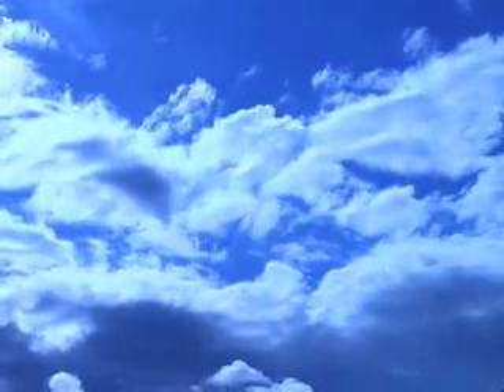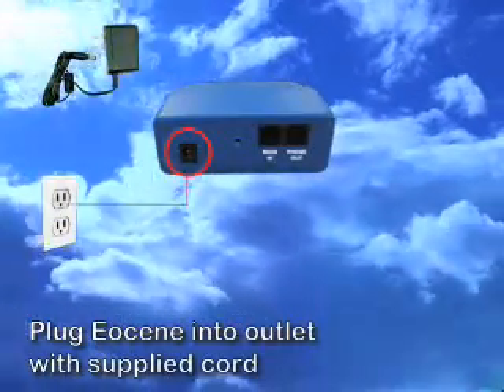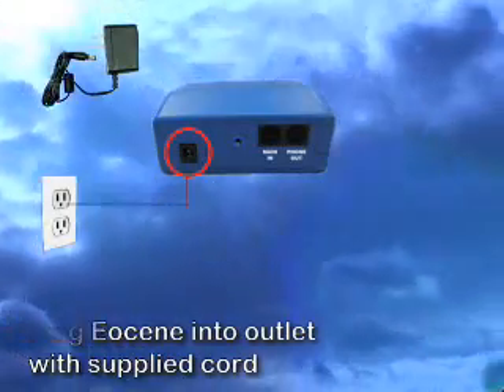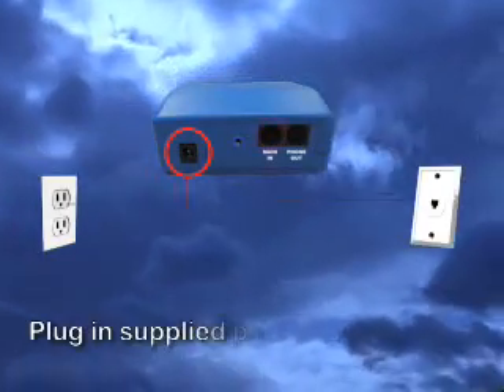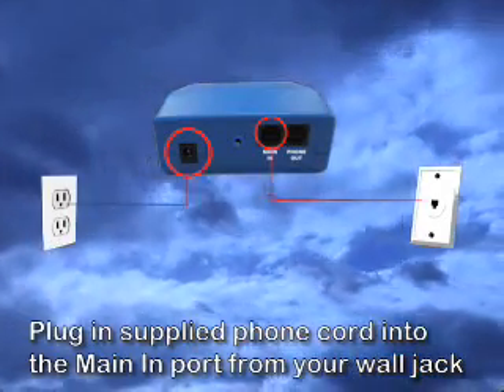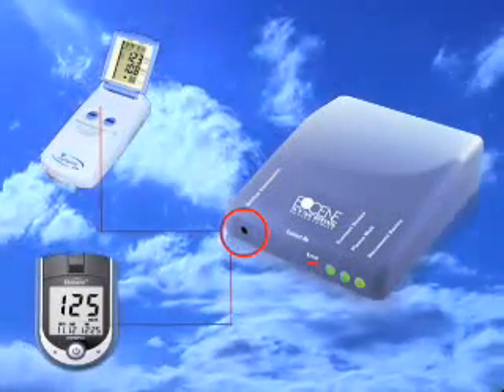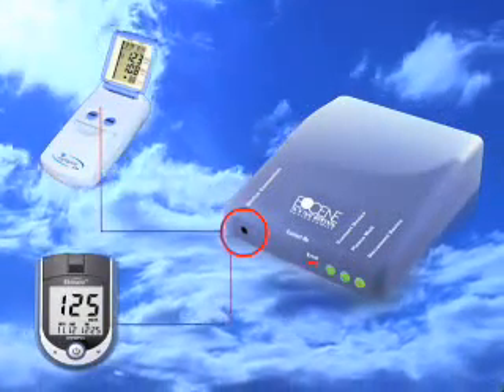The system is as easy as one, two, three. One: after the patient tests their blood sugar, they plug the Eosene with the supplied power adapter into the outlet. Two: plug the supplied phone cord into the wall jack and then into the Eosene device port labeled 'main in.' Three: plug in your healthcare device into the front port labeled 'device connection' and your results will automatically begin to download.